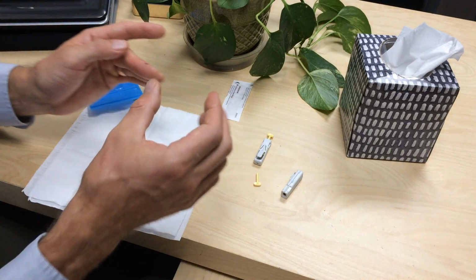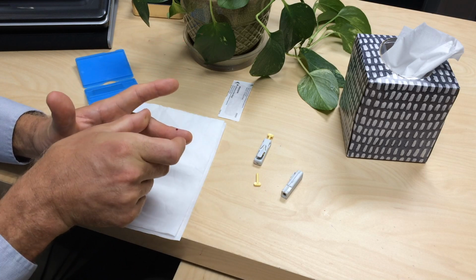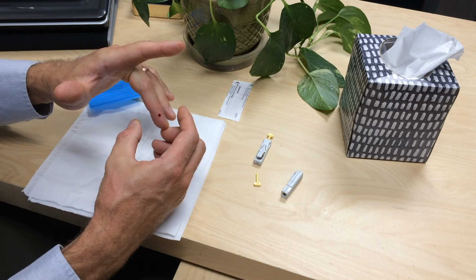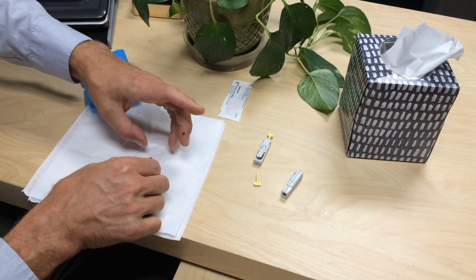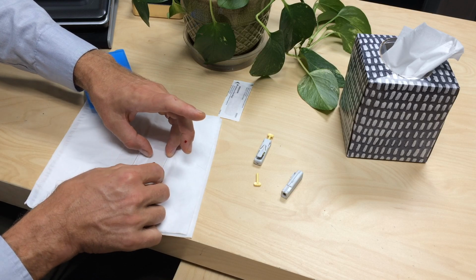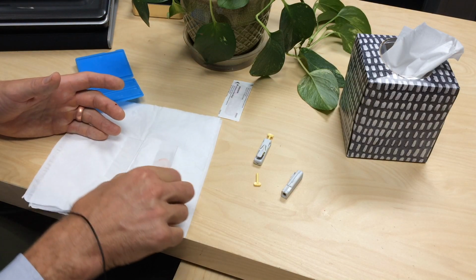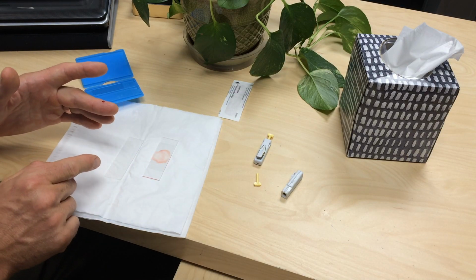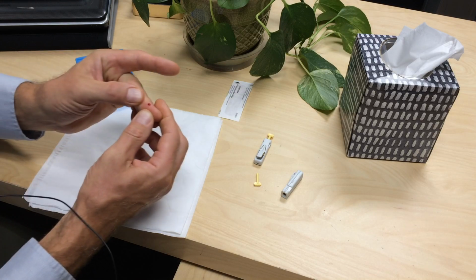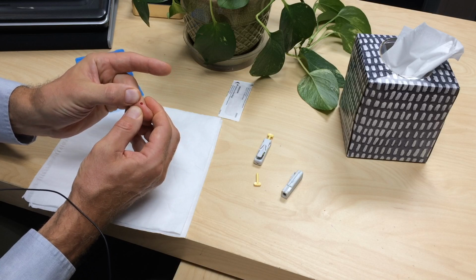Then we take the microscope slide cover and we're going to gently touch the blood without touching the finger. Just like that. Take the microscope slide cover and gently and carefully drop it onto the slide. And you'll have a slide that looks something like that. Now we're going to do the second collection. For this one, we can apply a little more pressure to the finger until we get a bulb of blood.